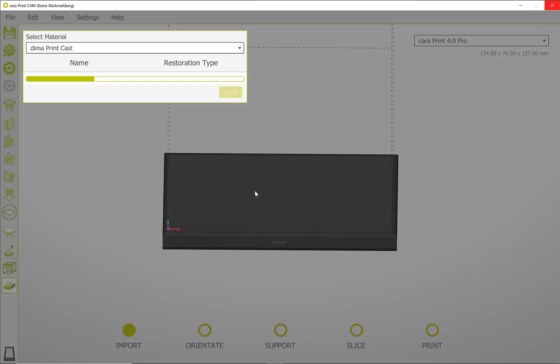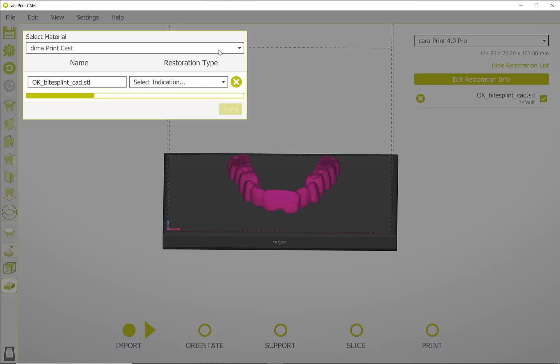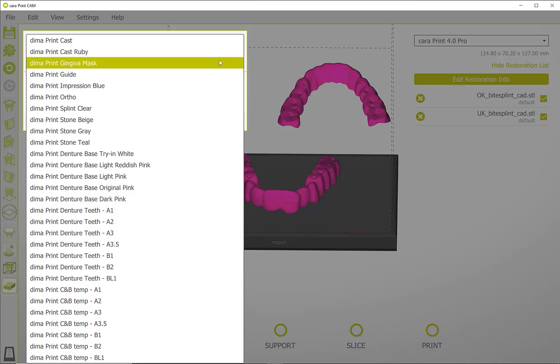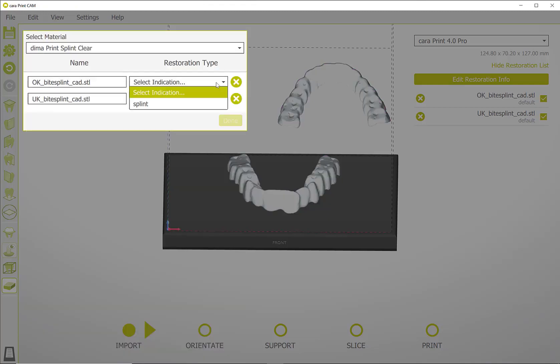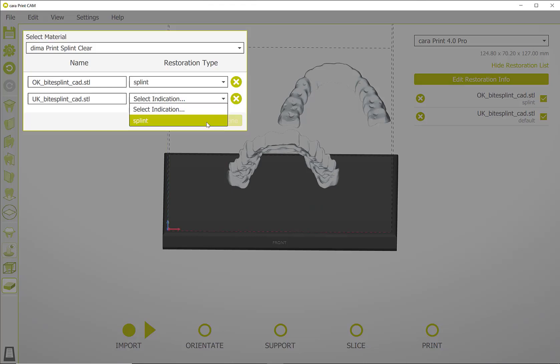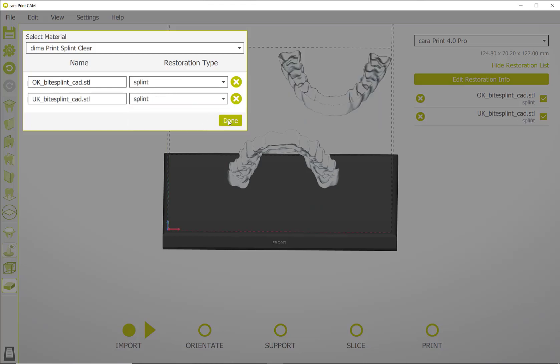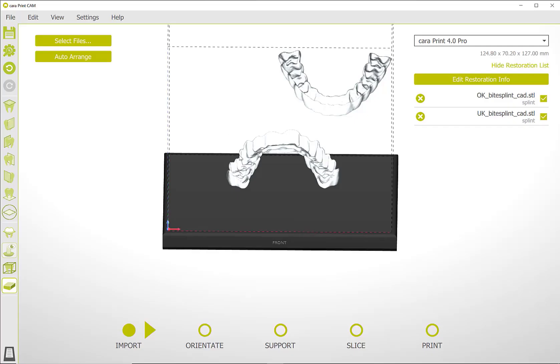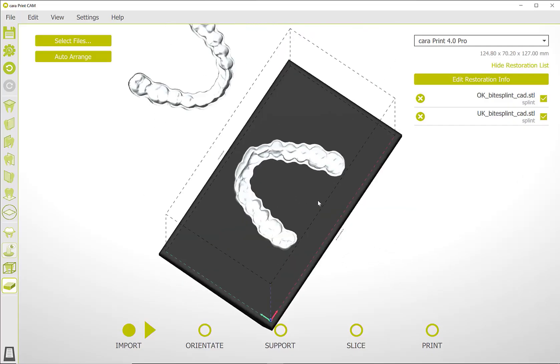After the files have been selected, assign the material with which the work is to be printed as well as the indication to the respective object. This selection will help the software to automatically orient and select the automatic supports.